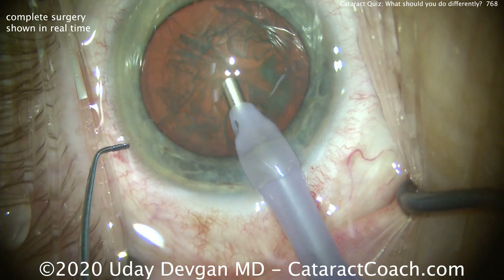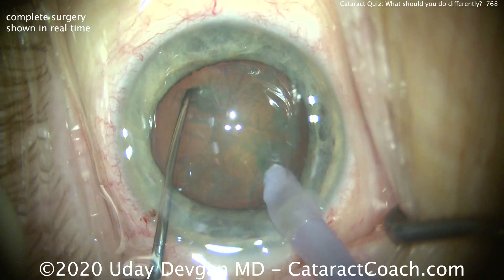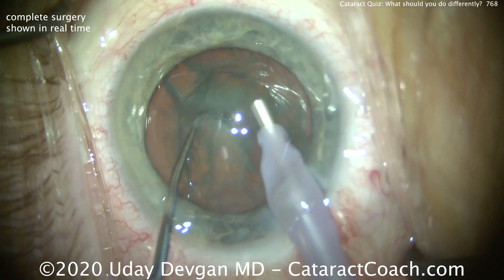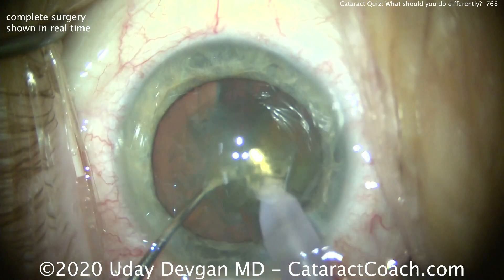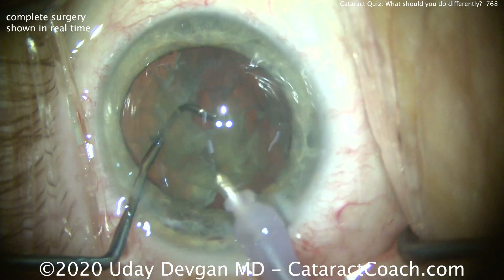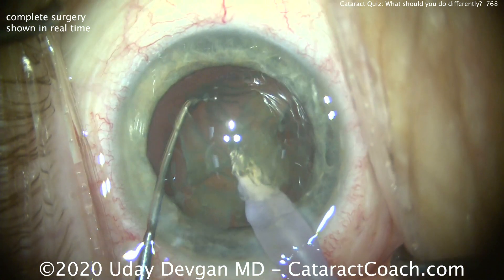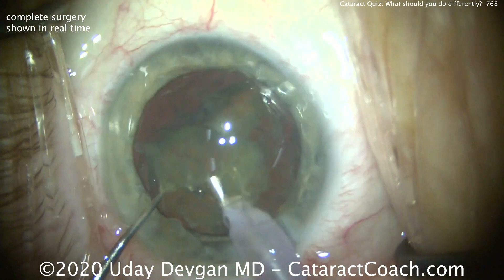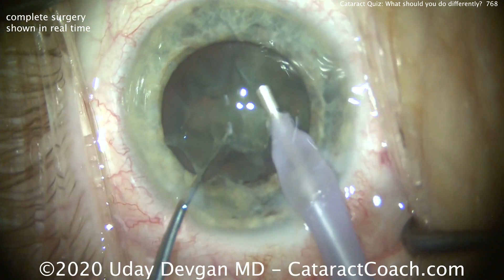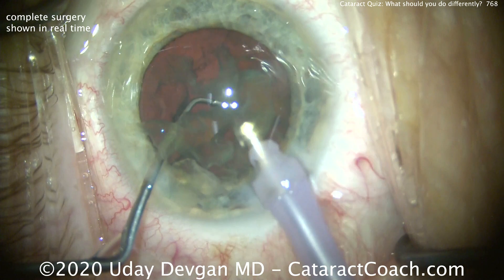The phaco probe's going in the eye, bevel down. We're going to try to stay away from the corneal endothelium. We'll buzz into the nucleus, dig in our chopper, and split the nucleus into two halves — all done within the capsular bag. In a case like this, I decrease my flow settings; I want to run less fluid through the eye. We can buzz and aspirate out the first heminucleus, staying away from the corneal endothelium, operating at the iris plane. The second half is brought up and we can chop it again, using a bare minimum amount of phaco energy. Less phaco energy and less fluid in the eye.